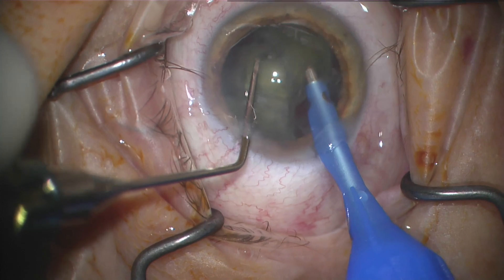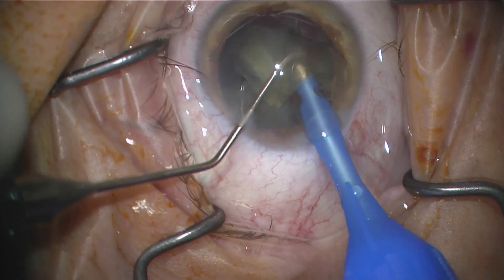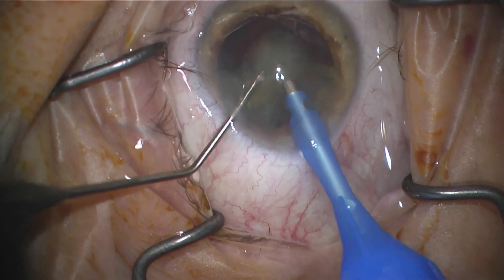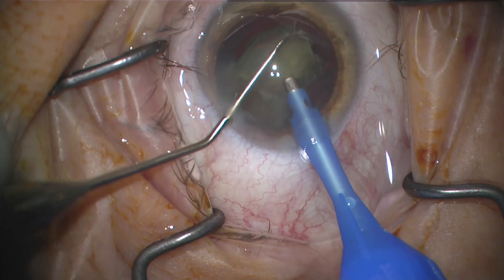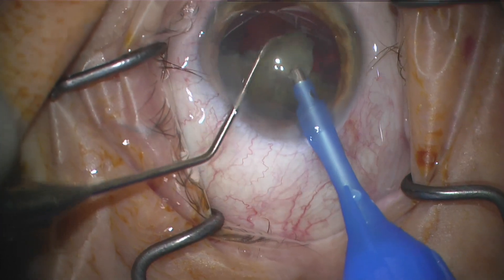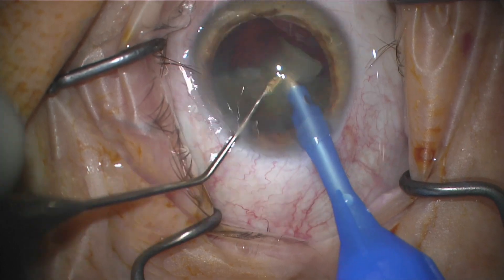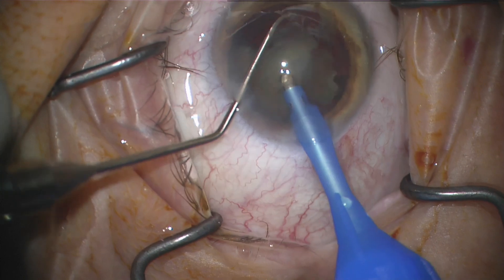You'd really have to push the throttle all the way down and aspirate the capsule to cut a hole in it. You certainly can, but just touching it like you do with other tips can break the bag — here it's not sharp. That's a disadvantage too because it's hard to sculpt into the piece, so I'm breaking it up a lot with my chopping.